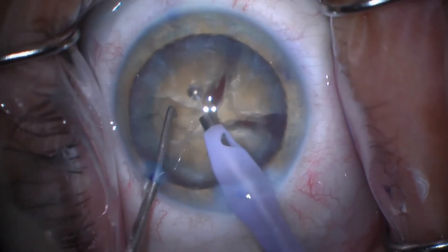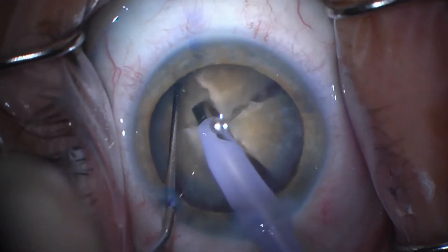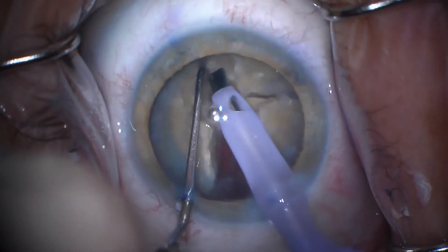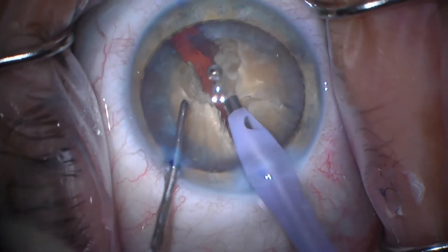Now this is a mistake I made right here. See this piece right here? I decided to just leave it in one piece. And later I'm going to show you why that was a mistake — I should have broken this into smaller pieces. I just was a little bit lazy here and I just didn't do the chopping I should have.